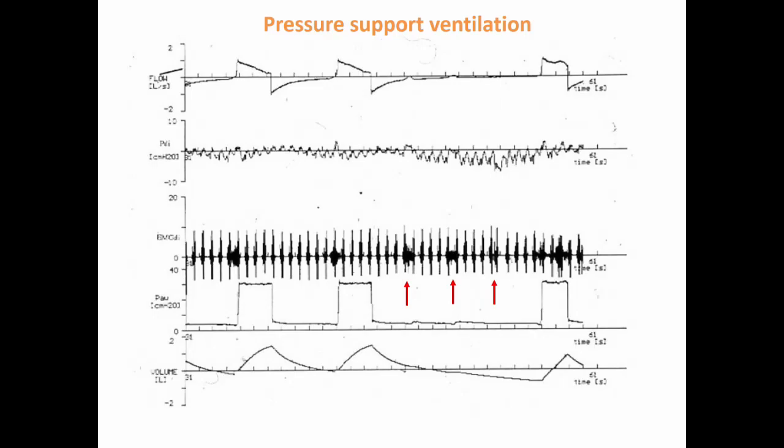Okay, sorry for the interruption, and I hope you can still hear me well. So I was describing these tracings where you see the patient becoming apneic for maybe 15, 20, 25 seconds. And we have realized that many patients, when they go to sleep with pressure support and receive a little bit too much ventilation with a little bit too low PCO2, they become apneic.